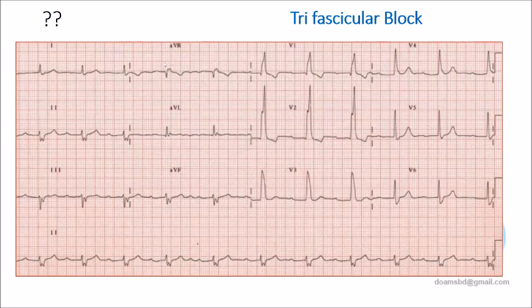Look at aVR. You see. aVR, is it normal? No. Doctor, is it normal? No. Is there fractionation or a W? Yes. So the right-sided block is there. We now have a right-sided block. If we find the left bundle component also there, then there will be three blocks. So identify on the left side, is there any block in the left bundle? You see V5, V6, is this wide or not? QRS?